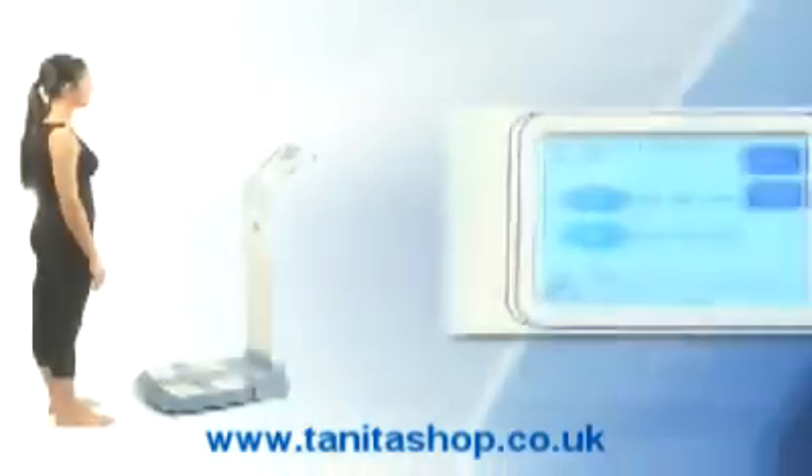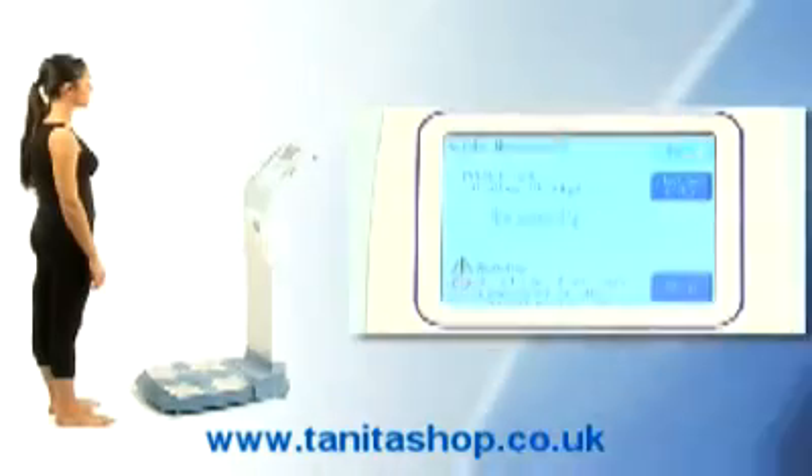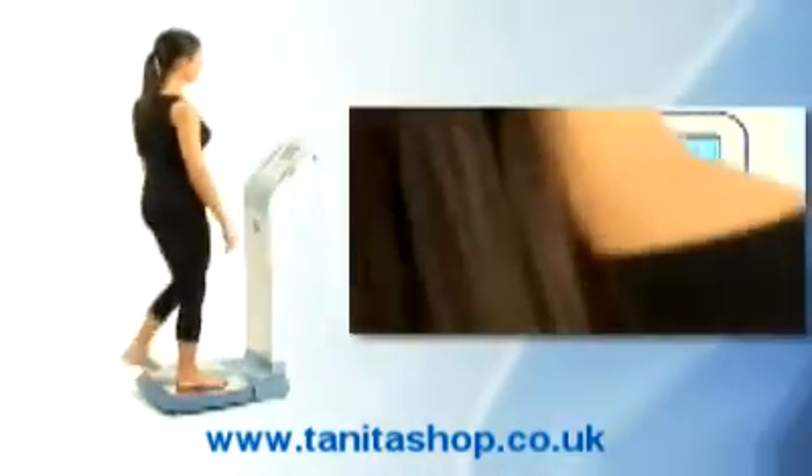The user-friendly touchscreen panel allows fast data entry for persons aged between 5 and 99 years. Simply select the function required: weight measurement only, or full body composition analysis. Stand barefoot on the four foot plates.